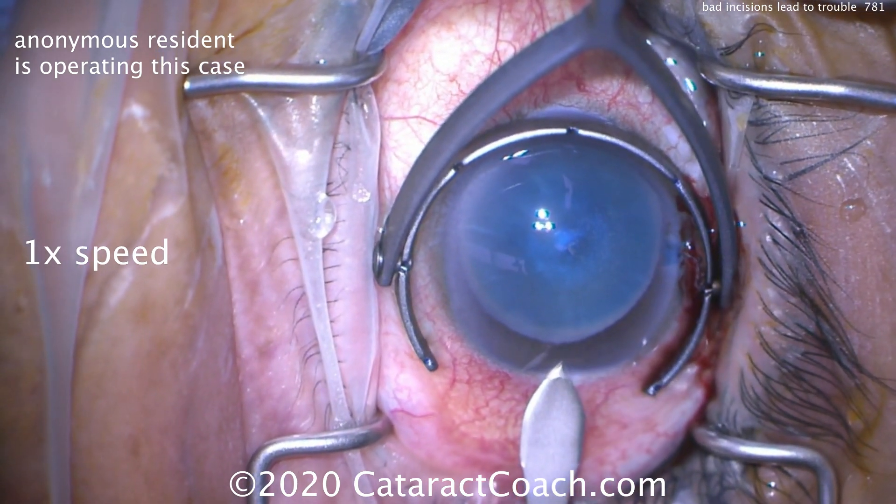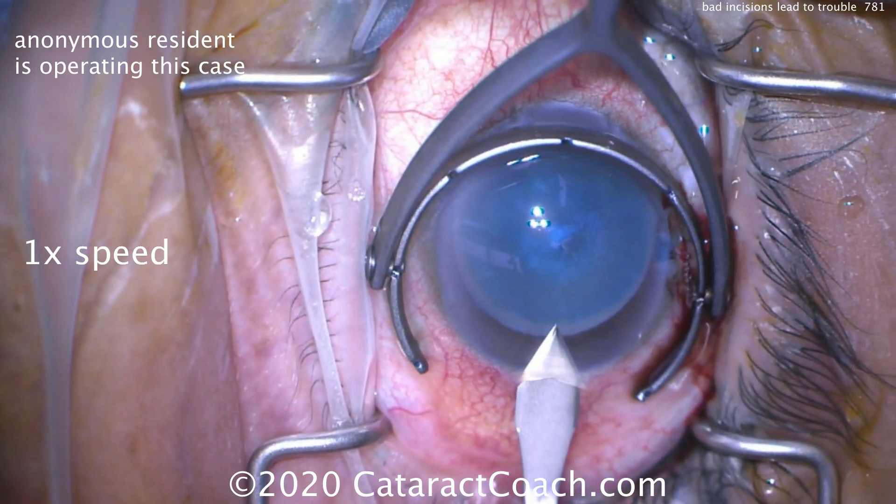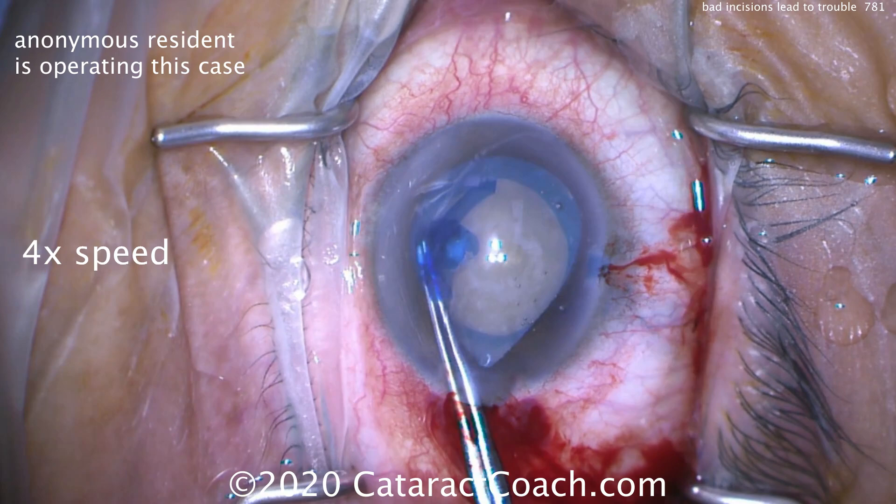The angle is going to be too steep, so the incision will be very short. And you've already committed — you've already entered the anterior chamber. Nothing you can do now but to proceed. There's the bleeding from the conjunctiva.